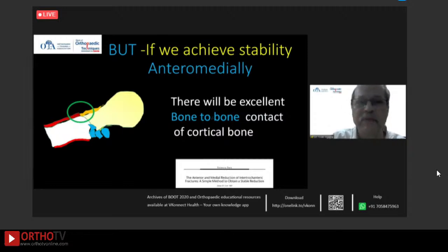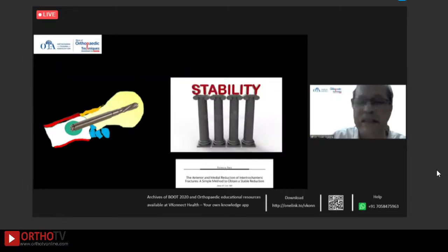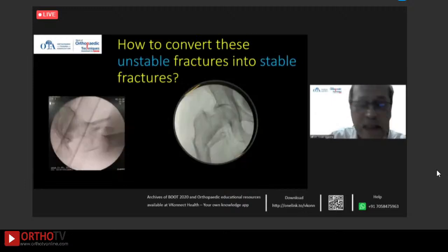On the other hand, if we try to achieve stability anteromedially, where there is a clean fracture line, there will be excellent bone-to-bone contact, as you can see here, of good cortical bone, and the implant would give additional stability because you have already converted an unstable fracture into a sort of stable fracture, and the implant gives additional stability and you will have a very happy situation. So the question is, how do you convert these unstable fractures into stable fractures?